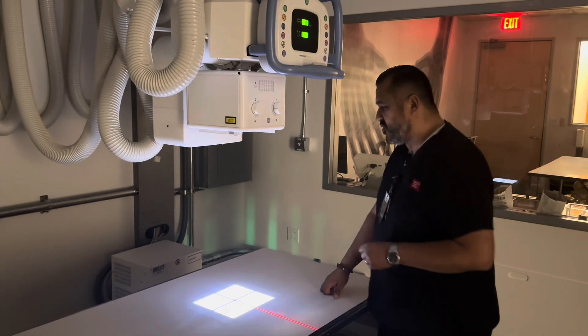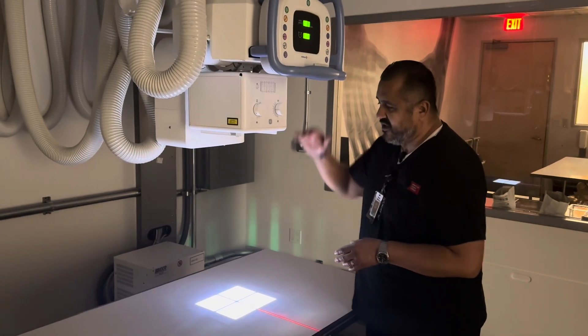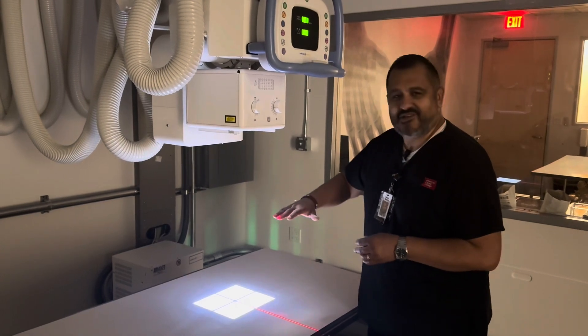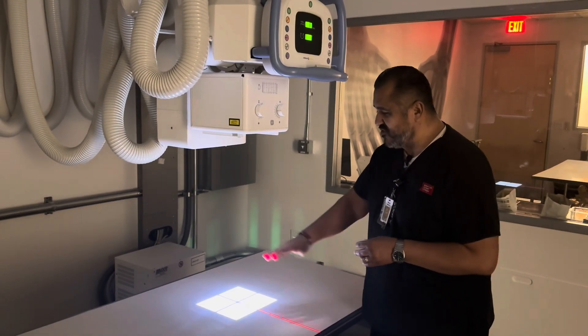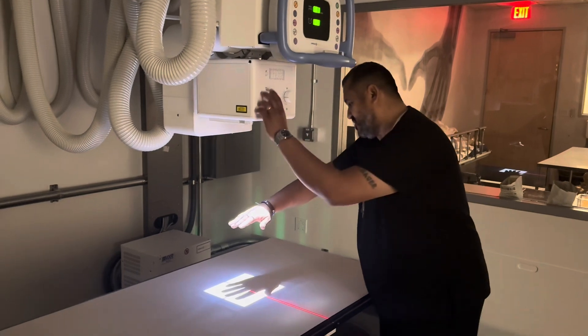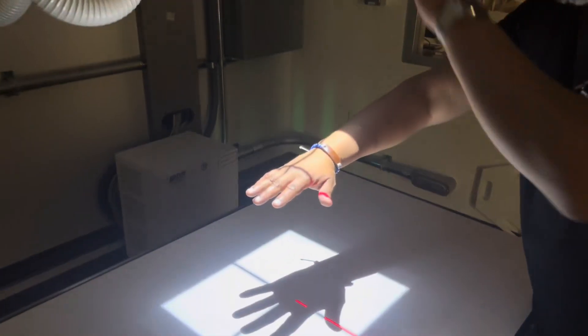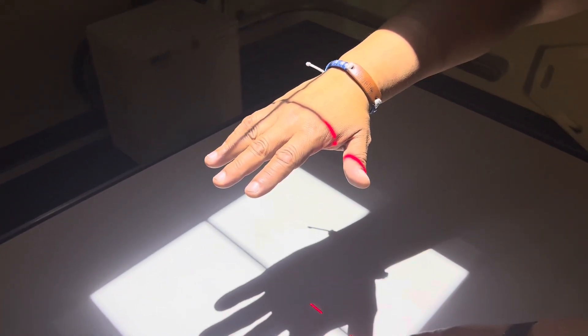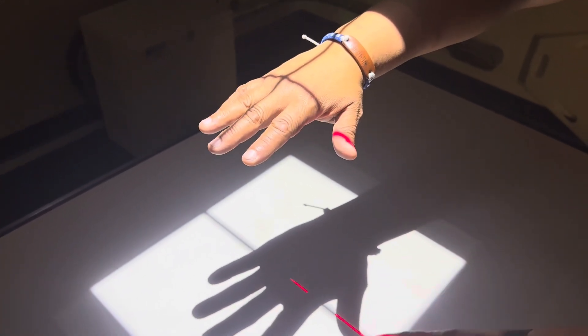Alright, so what we're going to show you really quick here is what happens when you increase your SID or decrease your SID and when you increase OID and decrease OID. So I'm going to show you with the shadow here. So I'm going to open up the collimation field here a bit bigger here. So this is OID, right? So if the image receptor was down here, right, I'm using the white table here just to show you a better example.